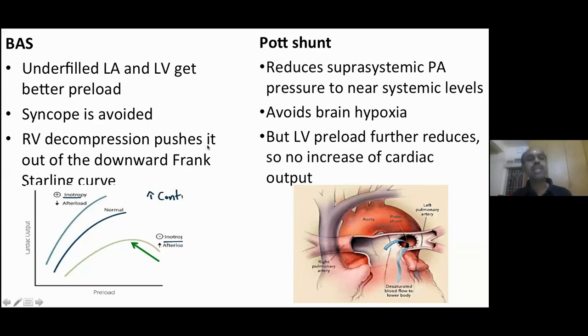Now when we ask the same question on balloon atrial septostomy, its mortality also has been quantified in Sandoval's analysis of more than 380 patients. The acute procedural mortality for a graded balloon atrial septostomy in the hospital varies between 7 to 8%. And if you include a 30-day mortality for a patient for a staged balloon dilatation, balloon atrial septostomy, it goes to around 20%. Basically, this represents the sickness of the subset.